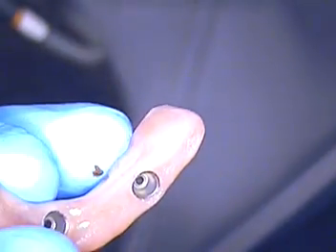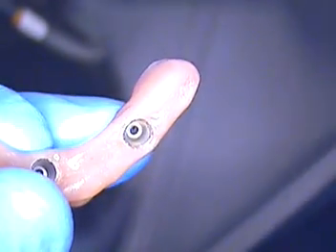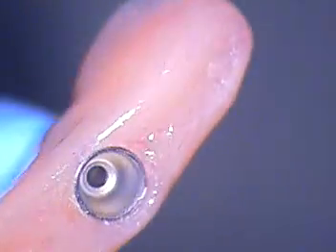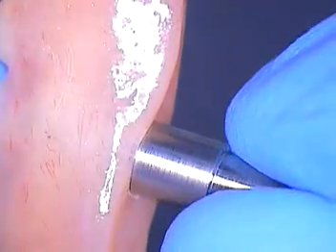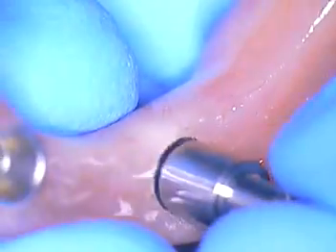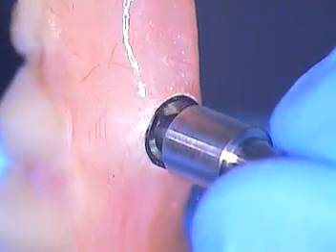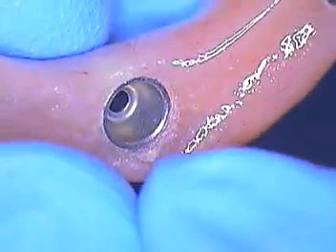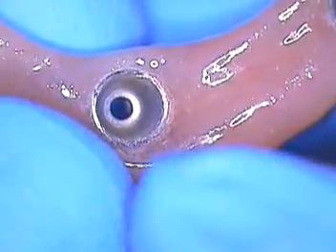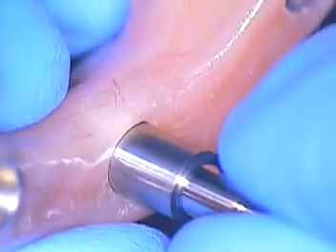Now the last thing that I did before I seated my patient, I wanted to be sure that my lab didn't have any of the sealer, and they did. They had a little bit of sealer that kind of rolled over to the metal, so I went ahead and double checked that. So here's an analog separate from the model. I'm just fit checking each one of these, and I now have a perfect fit on every one without any sealer interfering with this. Now the only other place I have to really double check is this right side, because we did drape some of the acrylic to cover the metal portion of the abutment.